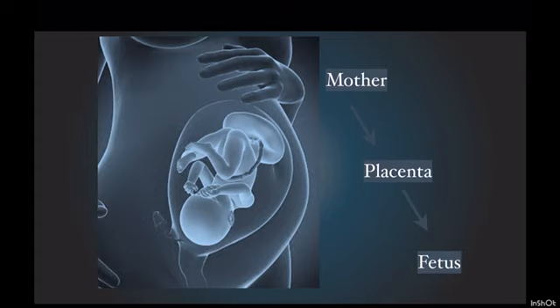Doppler is used to assess the well-being of the mother, placenta, and also the well-being of the fetus. In today's session, we are going to see the well-being from the maternal side and the placenta. Fetus we will see in part 2.